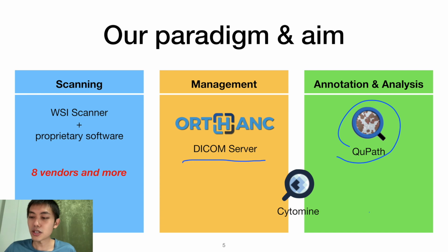And you cannot really retrieve images from the DICOM server to QuPath. So we hope to develop an interconnected environment for the digital pathology platform.